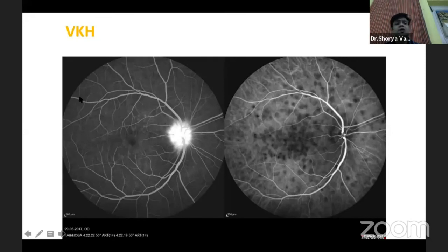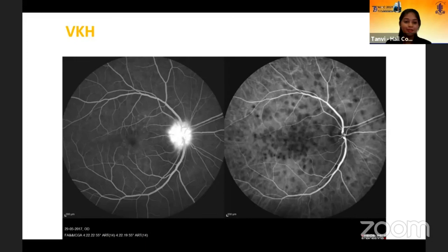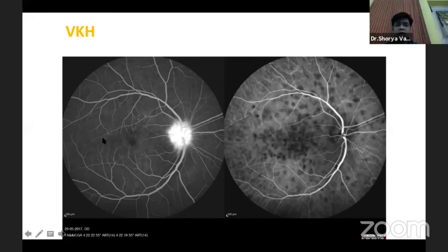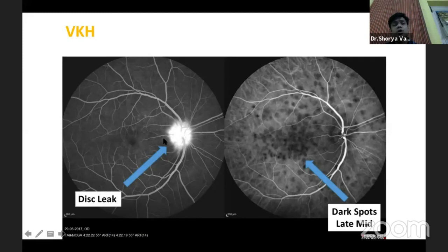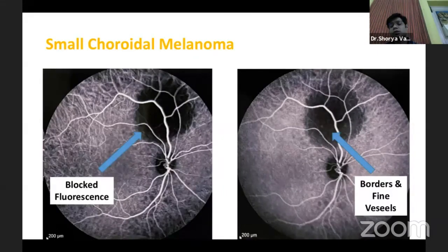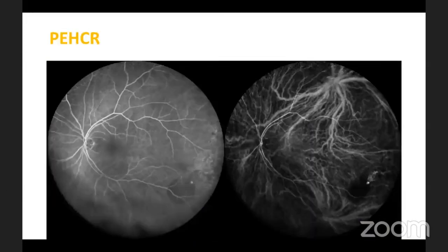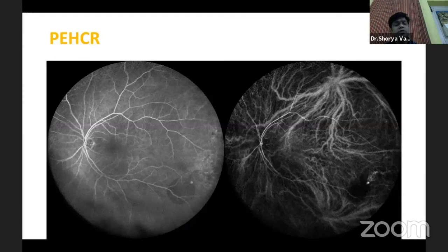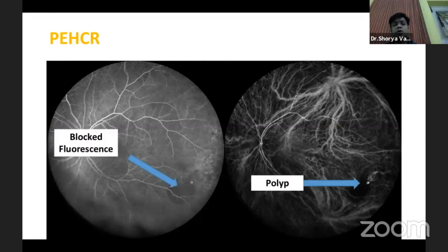In VKH, there is hyperfluorescence on fluorescein angiogram; however, on ICG we will not see this but will see dark spots in the late mid phase corresponding to choroidal hypoperfusion. In cases of choroidal tumors like a small melanoma, there may just be blocked fluorescence on FFA but the margins may be better seen on ICG. A peripheral lesion like peripheral exudative hemorrhagic retinopathy seen on wide-field angiography may show a sub-RPE bleed with a corresponding polyp on ICG.